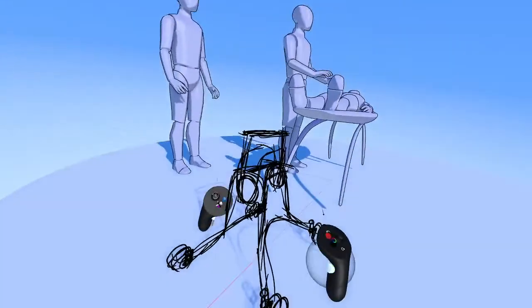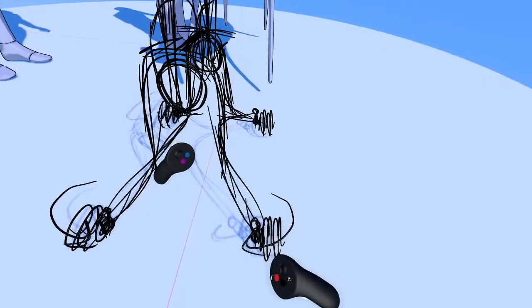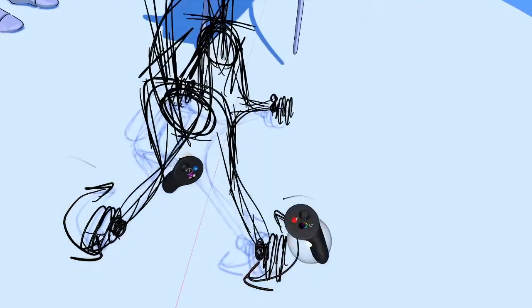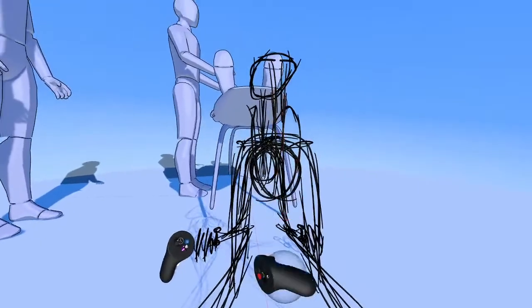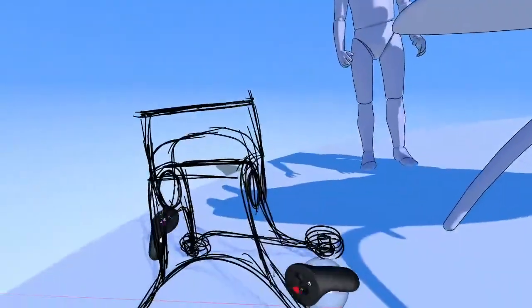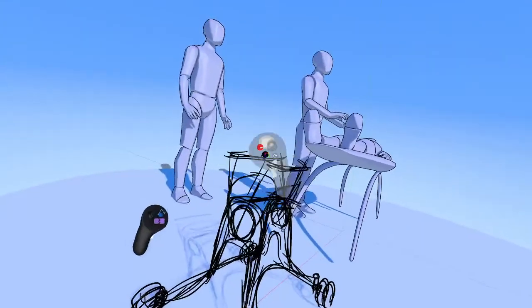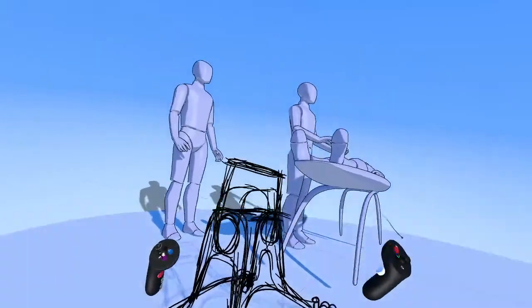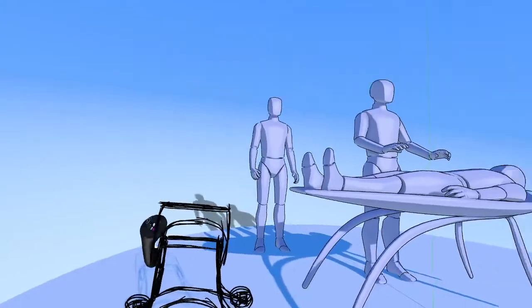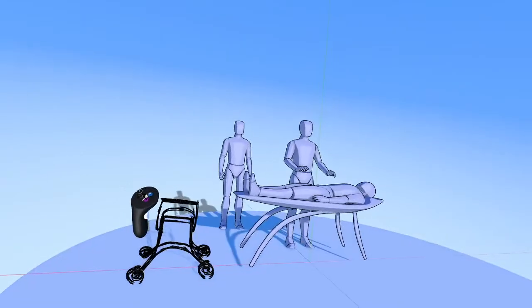All right, so what we have right here, I like so far because we have movement on the wheels. They can rotate freely, at least to a certain degree. All four of them turn, and then we have this nice sturdy base coming up into a pivot point for the upper body, and then we have this hinge thing here. Let's see if we can group it and sort of move it along. It's mirrored right now, so it's kind of hard to see, but it can rotate in that direction. And now let's start to think about how this is going to interface with everything else.